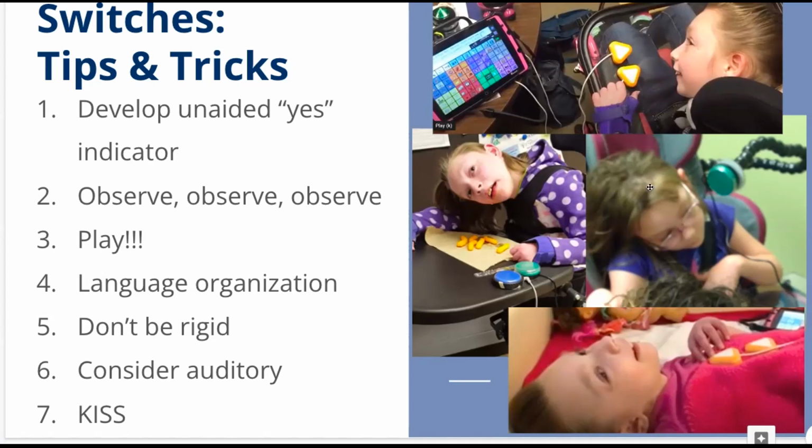The gumballs, so the middle green switch on the right-hand side on the modular hose is a gumball switch, and they started with just one switch, touch the switch and it would say more. That was only for a few moments just to kind of get the orientation, and this is at the very beginning of the video, so they had actually moved the switch closer to Haley to, again, improve that efficiency. And then Haley grew her switch skills almost immediately to 2-switch scanning.